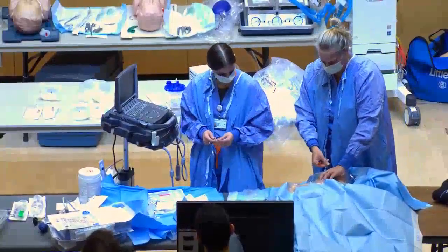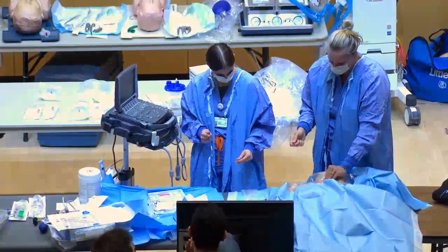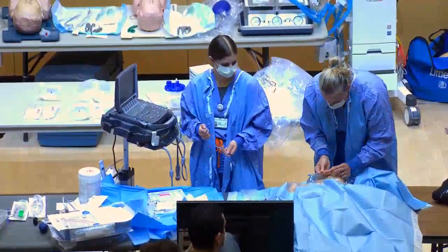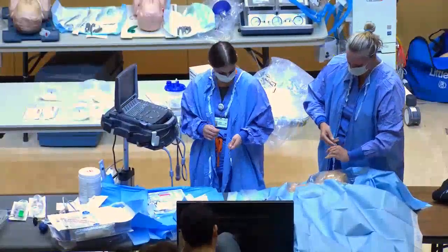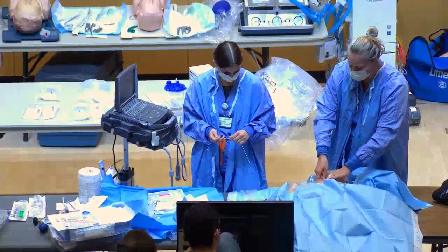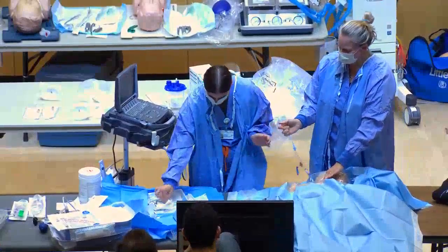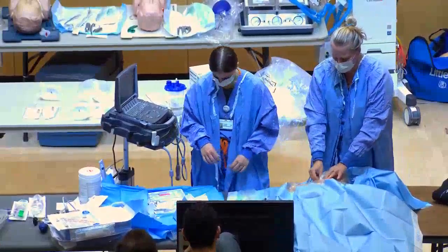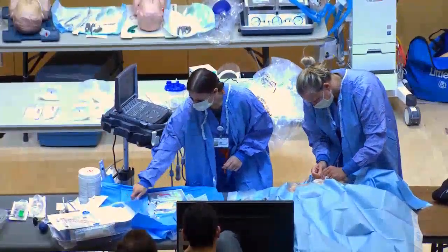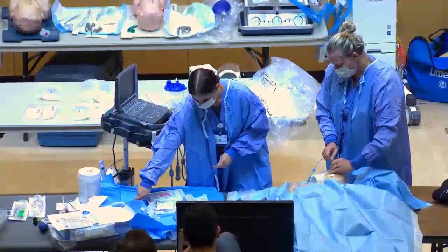Put the dilator over the wire, apply a little pressure, push through the skin — you'll feel a small pop. Remove the dilator while still holding onto the wire; it will bleed a little so use gauze to hold pressure on the skin.